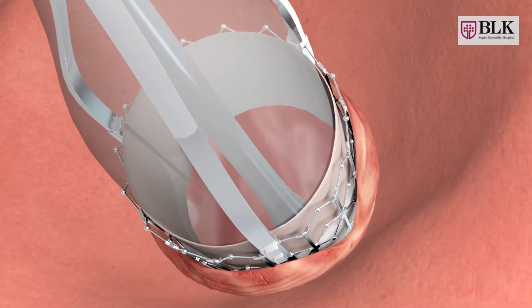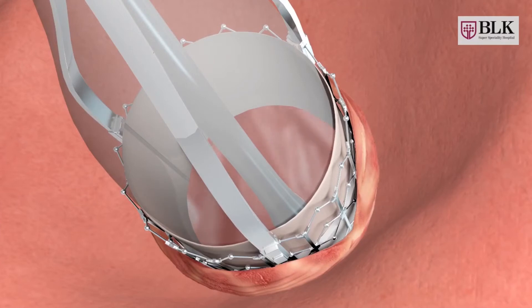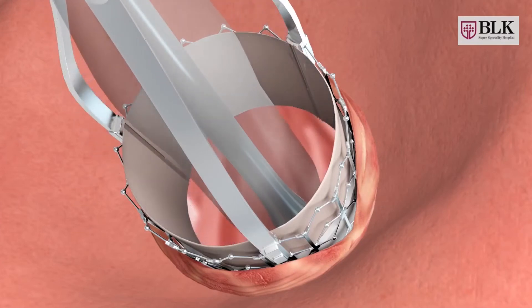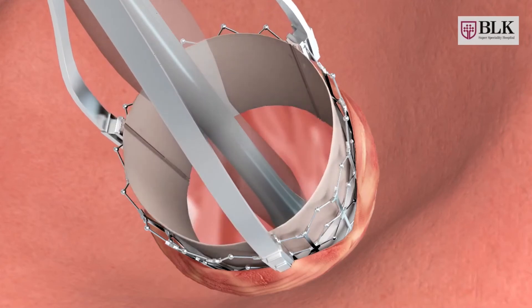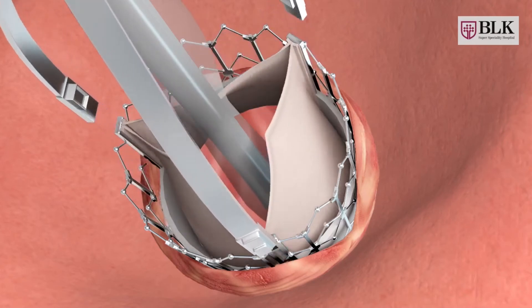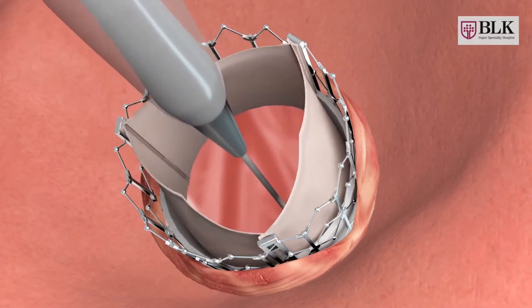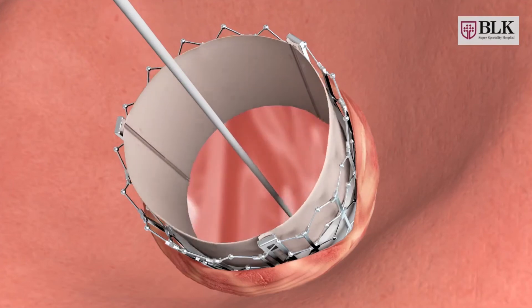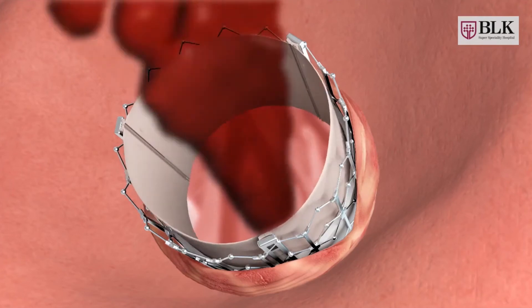We fix this valve. It's very important to check various things: what is the height, where exactly it has been placed. Now you can see that the catheter is being withdrawn and the valve has been put in place.